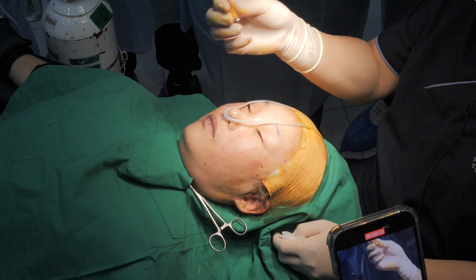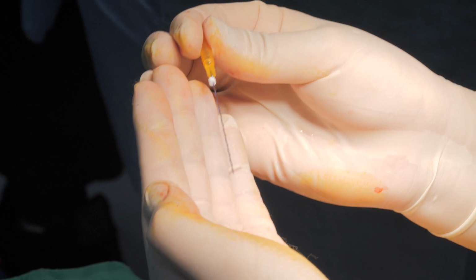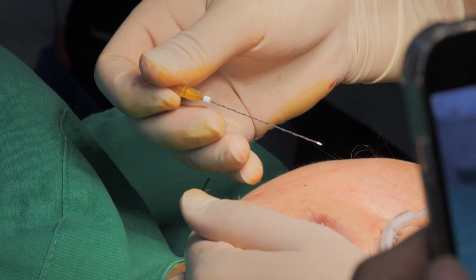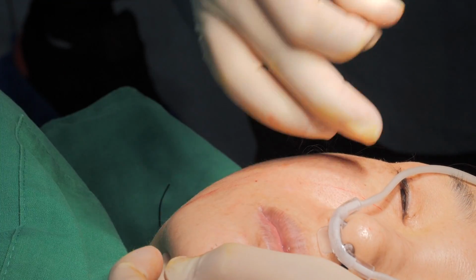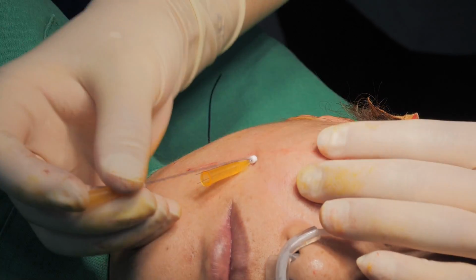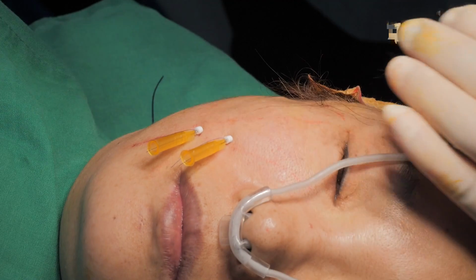What's this? It's a Cogging Screw Plus. I'm old, so I cannot find the tiny cogs on the shaft of the thread. But yes, it has cutting cogs on the surface. With thin thread, you should insert them very superficially for better result.